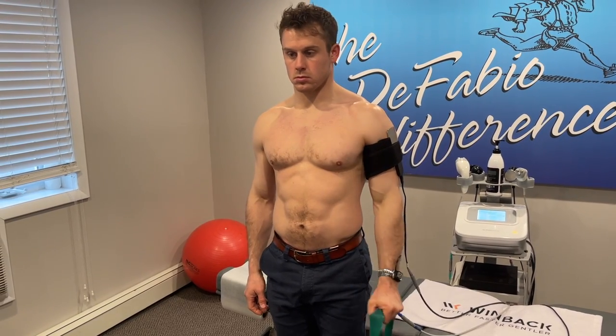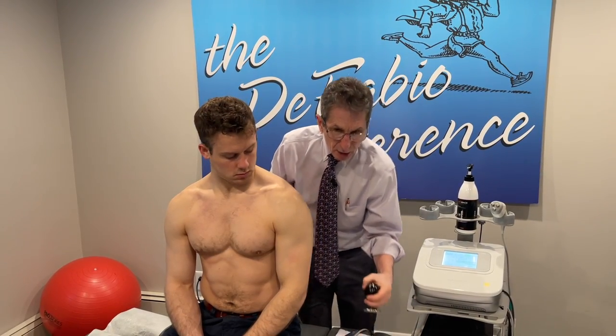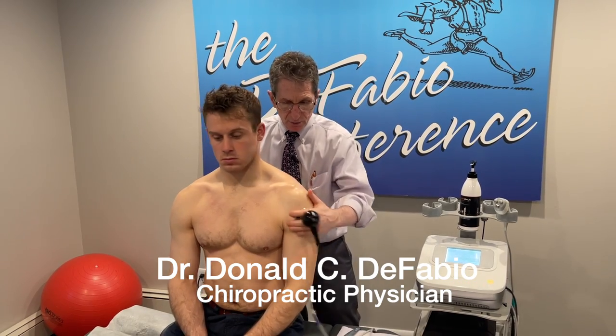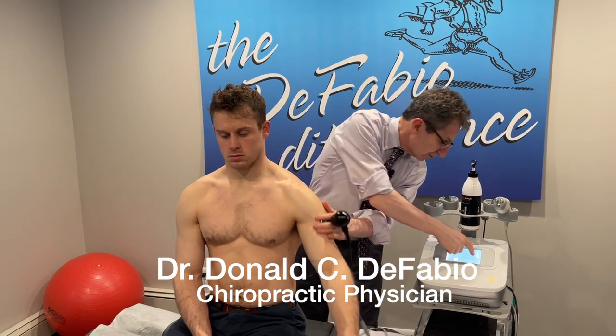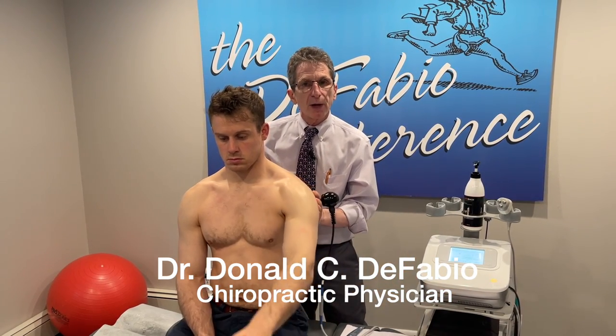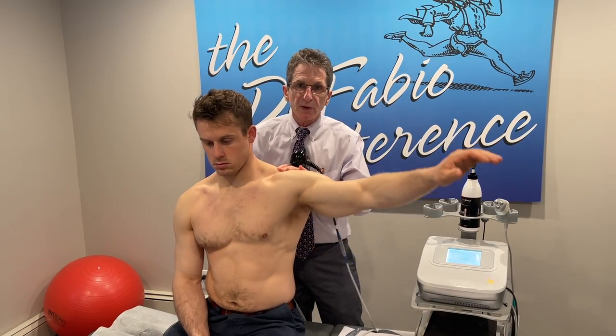What if we want to get deeper into the joint? What if we want to get down into the tissues where there's arthritis, or the tendons or the ligaments? We use the resistive mode. In the resistive mode there's not going to be heat, so I can hold it here — I don't feel any heat at all. But what the patient will feel is like a flushing, like a warmth of tissues.